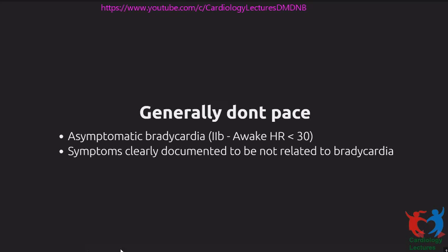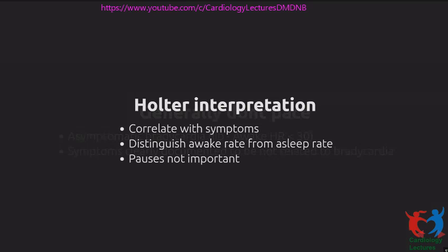Now, just note this term: awake heart rate. This is again something important. I'll keep coming back to this later also. I'll discuss this when we discuss Holters. A lot of these patients with sinus bradycardia end up getting a Holter because their outpatient ECG shows a heart rate of 50. They have some vague symptoms. So you put on a Holter.